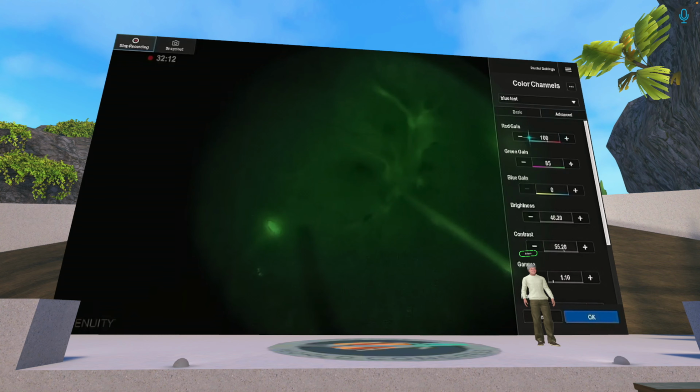So I think we can come up with something relatively standardized from the meeting that would be outstanding, and then we just have a caveat that, okay, these are the microscopes it appears to work on best. I think we need to share that as well.